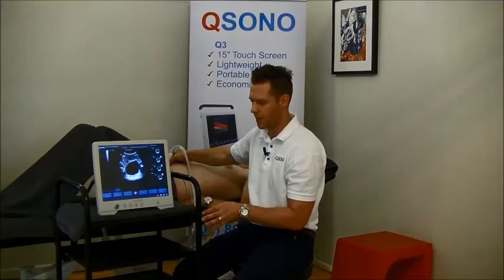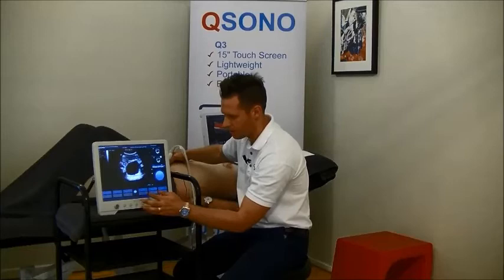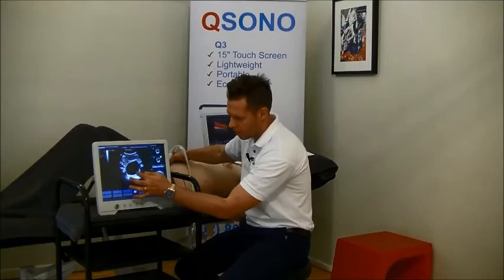So if I was to put a marker on that, I hit function, measure, and then I put my little marker down here at the bottom of the bladder base, we can actually measure the bladder base elevation with that movement. So again, I'm just going to guess where the bladder is going to get to, and I can move this as I go.